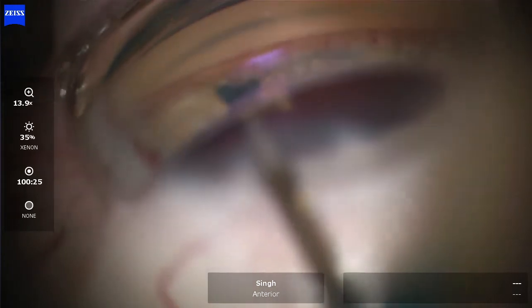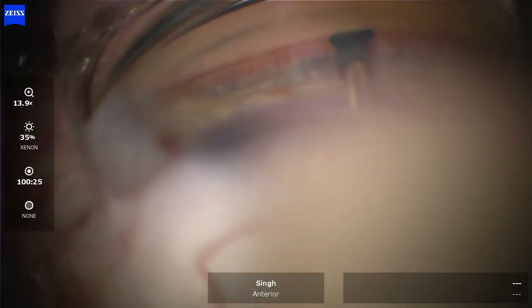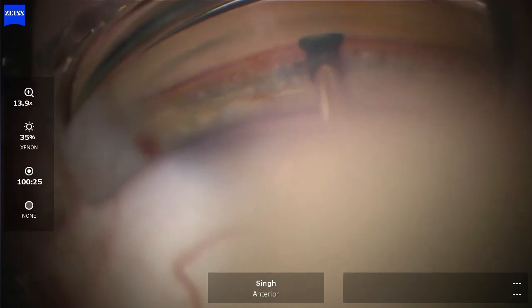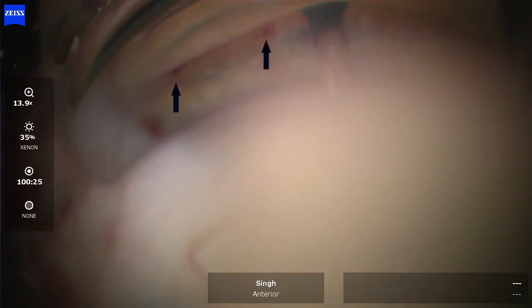Now it's going to seem like I didn't do much there — you might wonder whether I really made a goniotomy or not. But watch what happens now after a few seconds: you can see that reflux of blood from the canal through those microgoniotomies, which really does confirm that we have created a microgoniotomy.